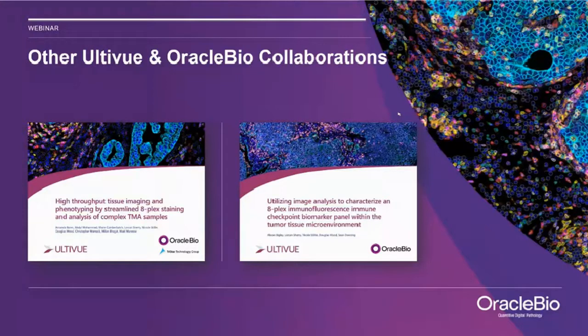But as I said in my presentation, along with the visual review, we also incorporate data such as the mean and sum of the pixel intensities per marker within tissue ROIs across image sets. And this gives us a better understanding of the variance of marker staining to make this process less subjective. Maybe just to touch upon the interaction that we have with pathologists as part of the process. Our pathologists can help us in choosing particular markers, but they also help us with respect to the validation of the algorithms. And again, this can happen at different levels.